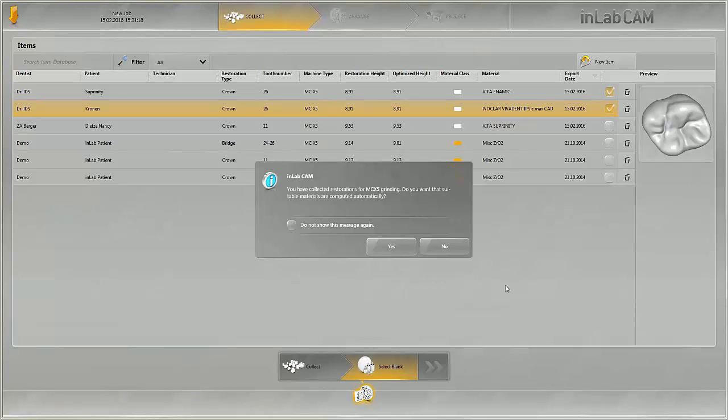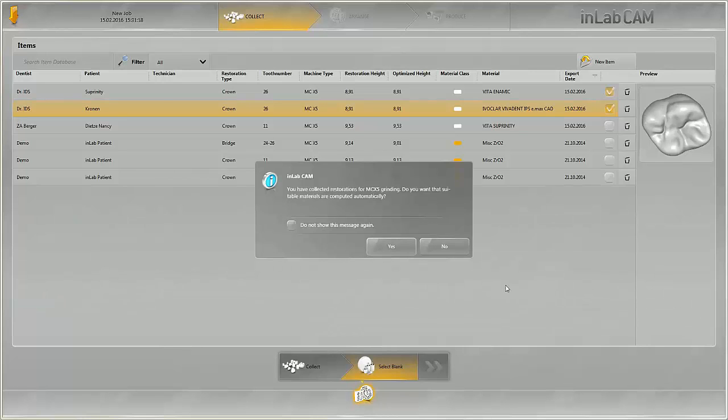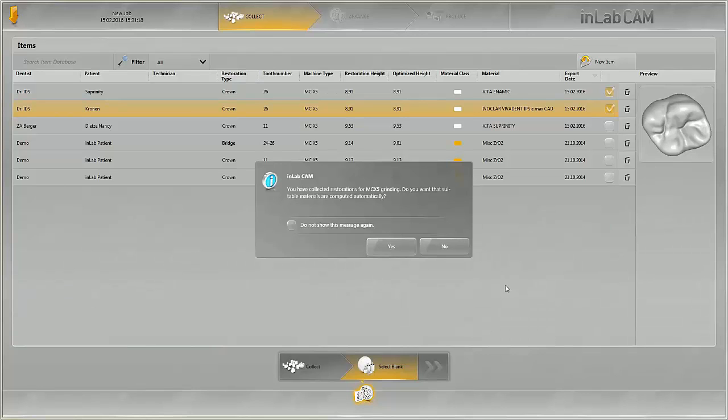You are asked whether the right materials should be selected automatically by the system or whether this is to be done manually. If you have saved the available materials and block sizes you use in your lab during the configuration of the InLab CAM software, the system will select these accordingly.